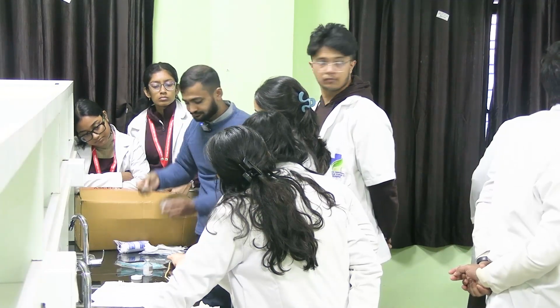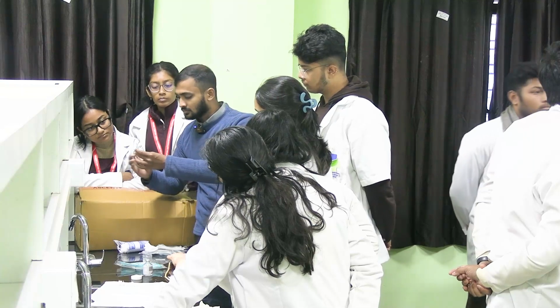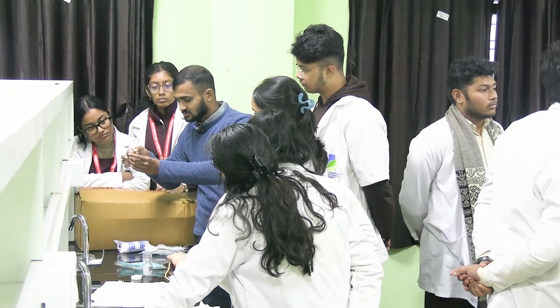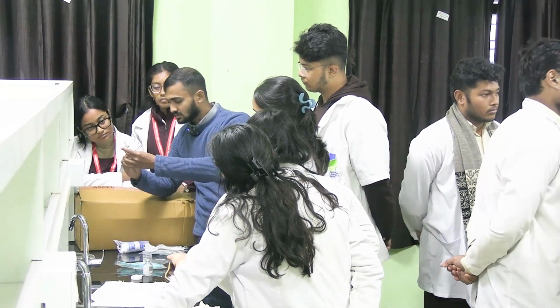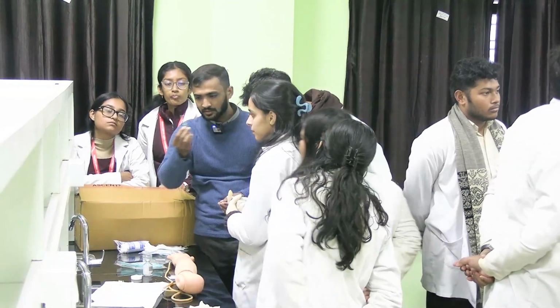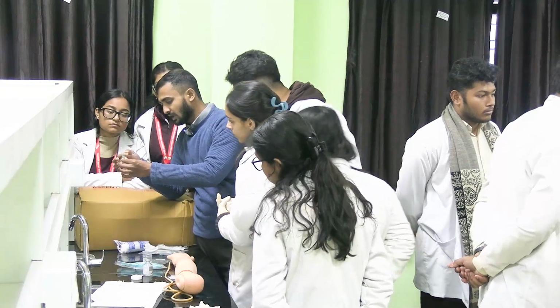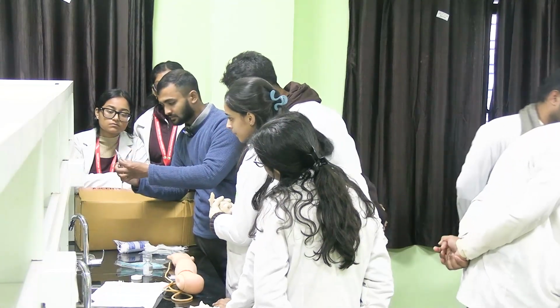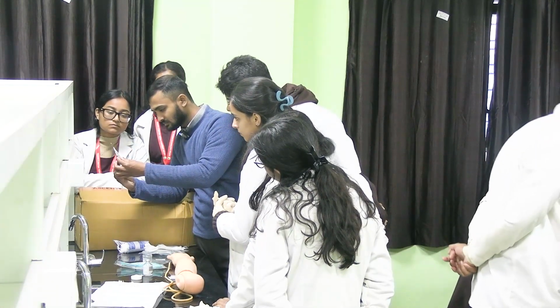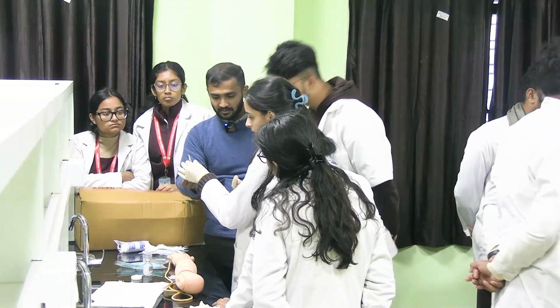Why? For air bubbles and also wastage. Sometimes it gets wasted. So I am taking how much ml here? 1.1. So I will be removing the air bubbles like this, by tapping. Now I have taken properly 1 ml.